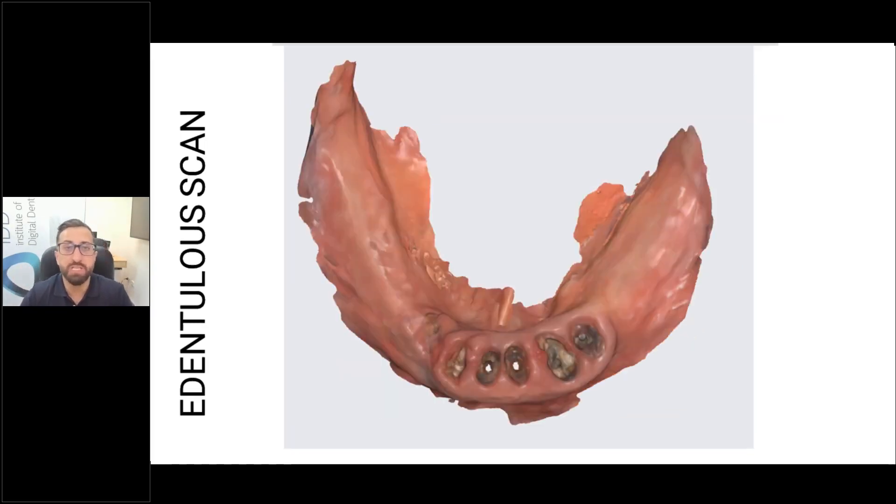A lower mandibular edentulous ridge is one of the hardest things to scan because you have the tongue, the ridge is often very resorbed, the floor of the mouth moves up and down, and you have the cheeks. The key is soft tissue control — retract the cheeks and hold the tongue really well. If you scan an area and then the tongue moves and the floor of the mouth moves, it makes it very hard to continue. You need everything to be immobile. Dry the area and scan it.